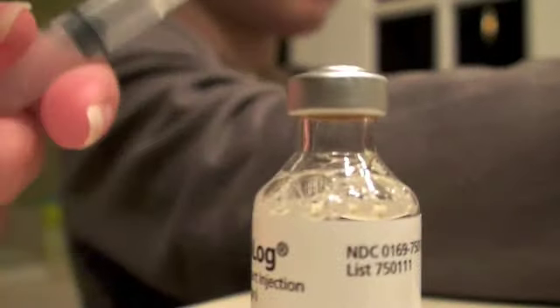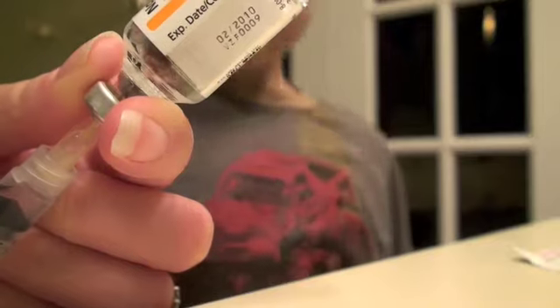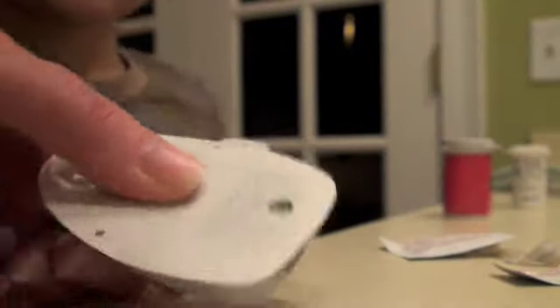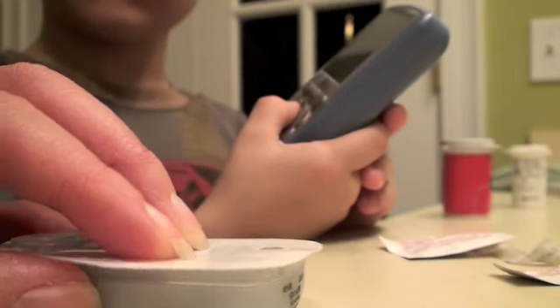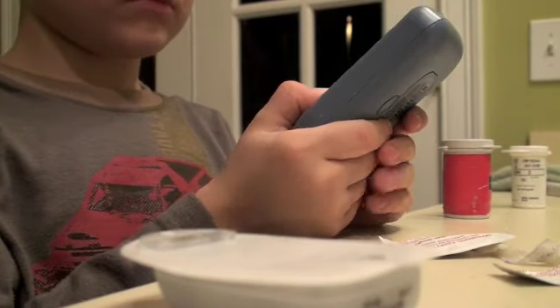Now we're going to get some air in here. We put air in the vial. We're going to fill it up. Put the needle in the hole. Everybody be quiet. It peeped. Okay, so now you can prime it. Next.